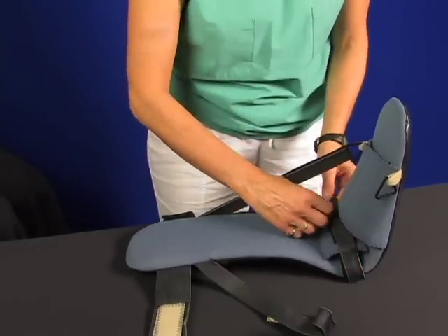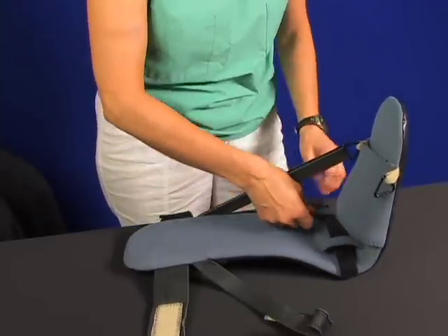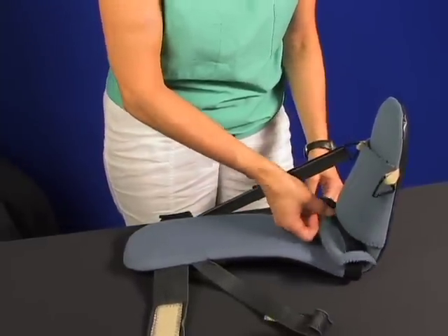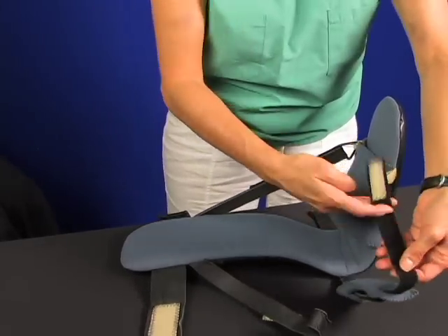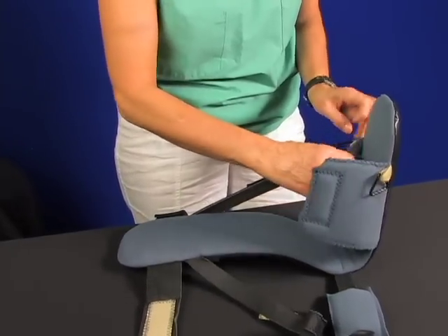Now go to the instep and disconnect the instep strap. Open it up and swing the strap pad out to the side. You can fold the hook back onto the strap temporarily. Then open the foot cover.